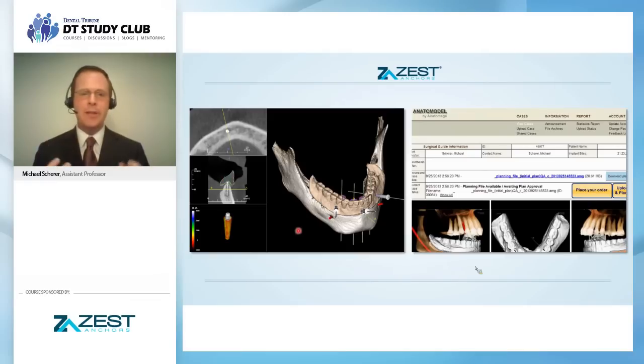Because we know that we can see cortical bone between soft tissue very easily, because cortical bone has a very high radiodensity, whereas soft tissue has a very low radiodensity that is very similar to acrylic resin, where white space or black space, the negative space, has a very, very low radiodensity. So if we create an air pocket, an airspace around the denture, then we can discern the two very easily.